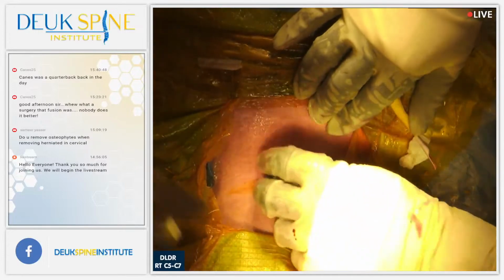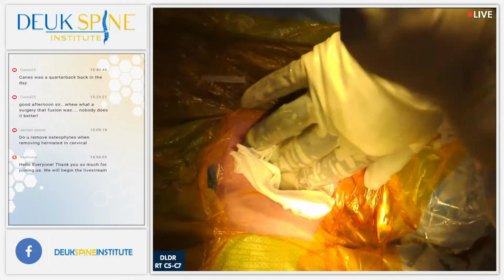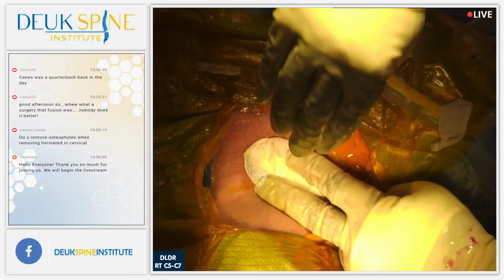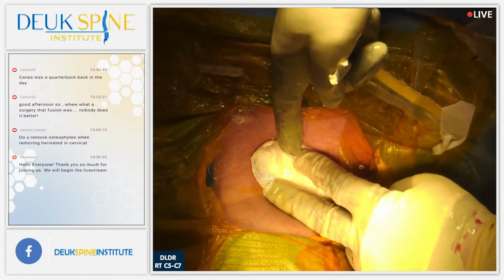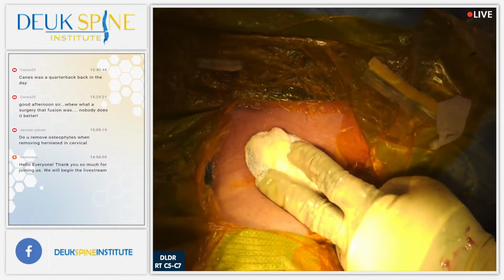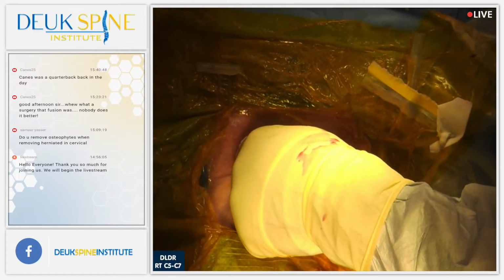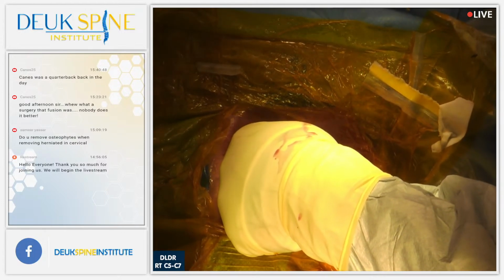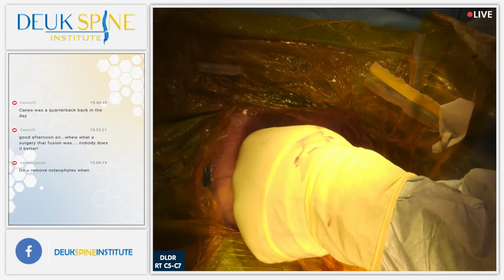All right, looking good. A little bit of venous bleeding. We'll put some pressure for a few minutes and then it'll be fine. But basically, the difficulty here was the collarbone, and he's a former football player. His collarbone is here, and man, that thing is strong. I needed to get this angle to get to 6-7 and get the whole disc, and the collarbone kept me from coming down. So we were always fighting the angle the whole time, but I think we definitely got 50%. Is that enough? I don't know. We'll just have to wait and see. I hope it is. The good news is that if the disc heals up properly after surgery, which I expect it will, and we get enough of it, he's going to have good relief and it won't come back.